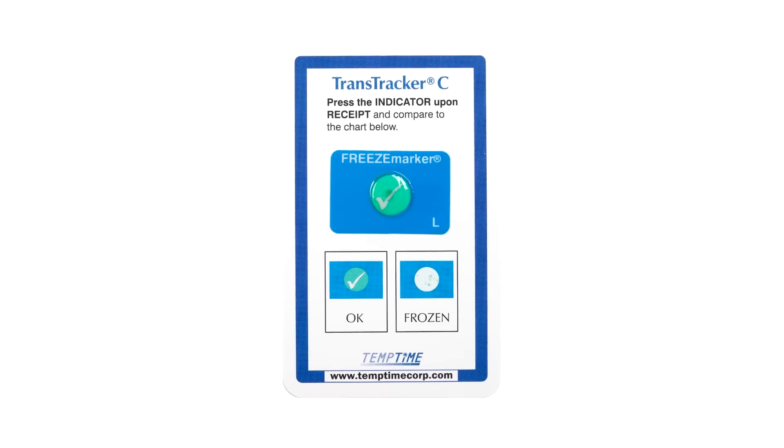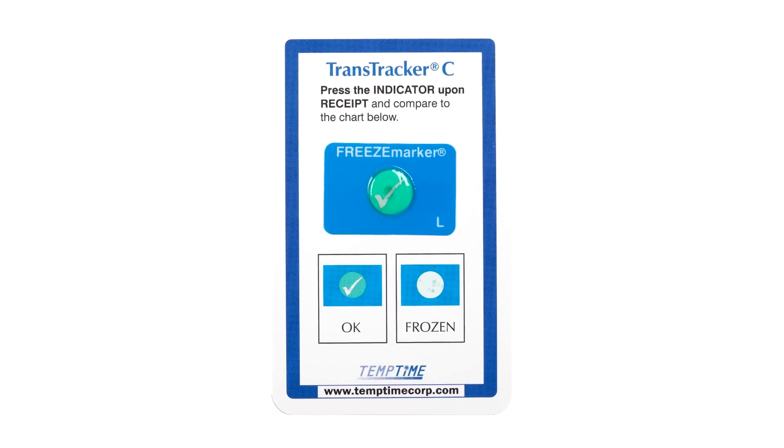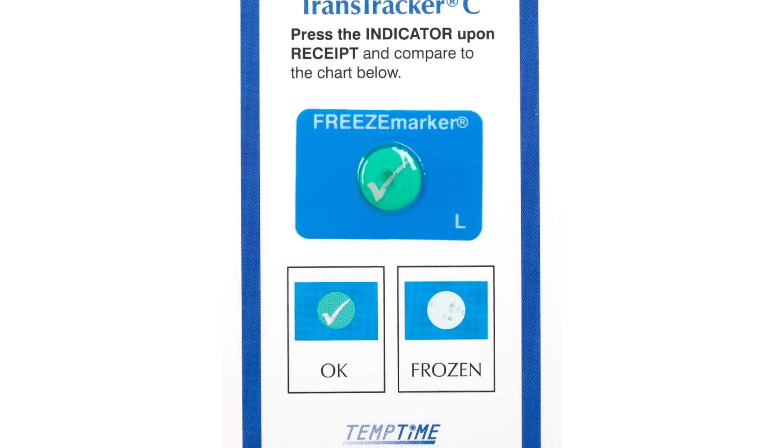The TranTracker C is a visible means to verify that the product has been maintained at the proper temperature and has not been exposed to freezing temperatures throughout shipment. The TranTracker C you've received looks like this: there's a small blue label with a green dot containing a check mark. In the middle of your TranTracker C there's a fluid-filled bubble or blister in the center of the blue label.